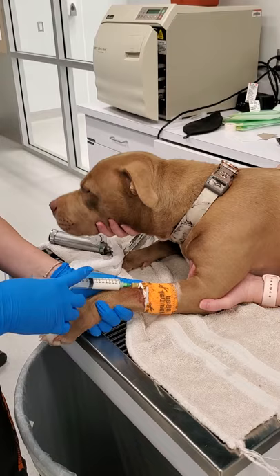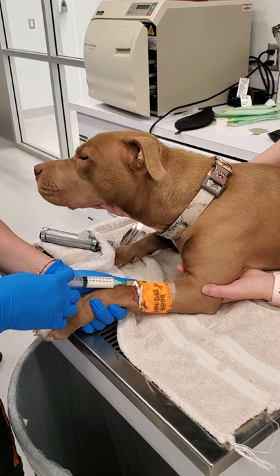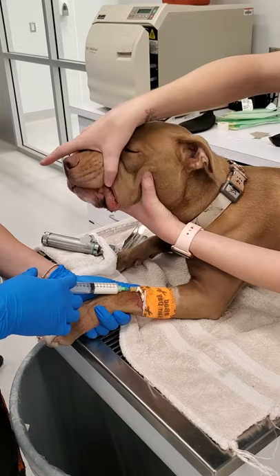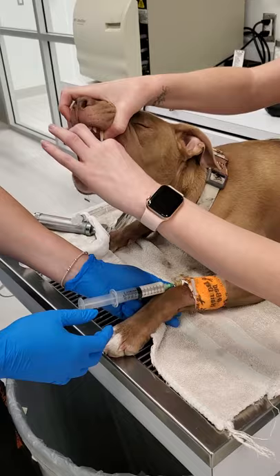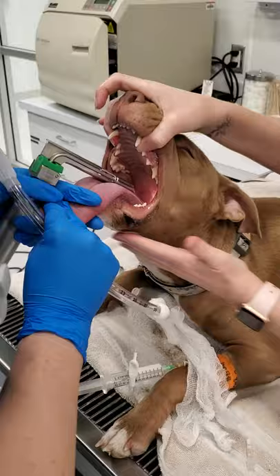I can actually feel her head getting a lot heavier. She's still fighting it a little bit. I'm checking her jaw tone. I think we're going to be good. Super important when holding for intubation — I'm going to hold the top jaw here with my hands right behind her canine, and then I'm going to make sure that her neck is stretched out nicely.